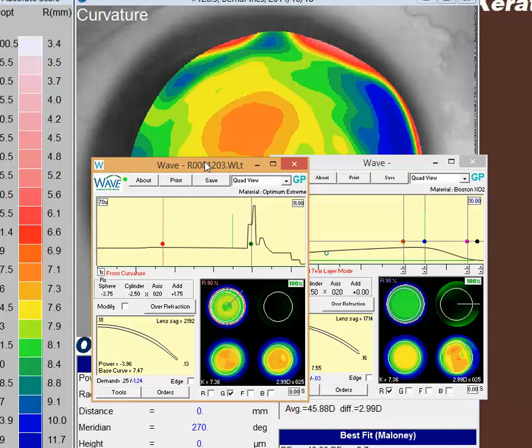Obviously in this case, since you have the weird overrefraction, anything to do with the pupil is kind of irrelevant until you get the overrefraction portion fixed. So I would concentrate on redesigning the lens from scratch. Do not average out the astigmatism in this case, and I think that will probably get you much closer on the final result. Well, I hope that helps you out.